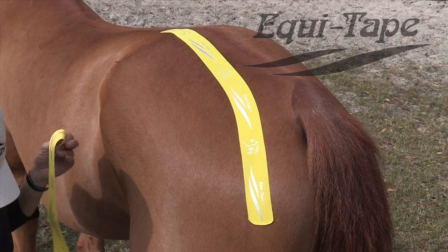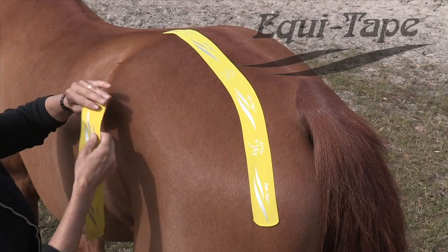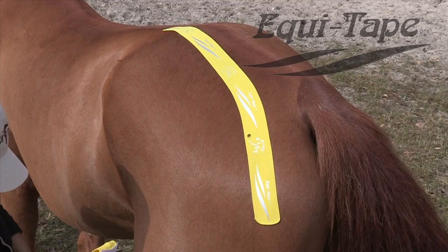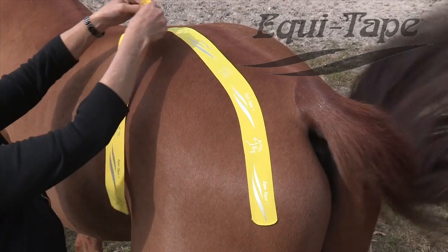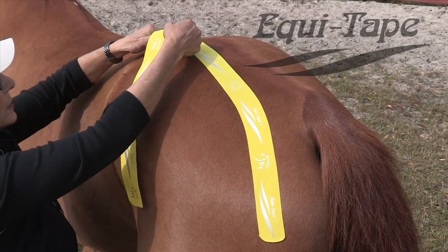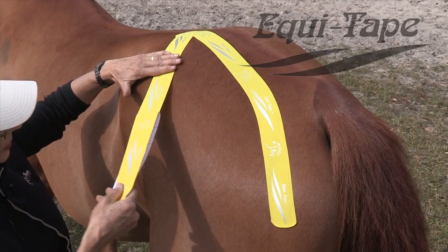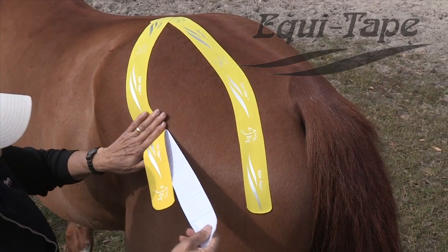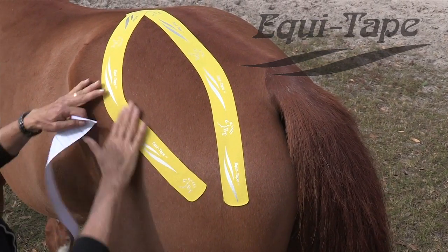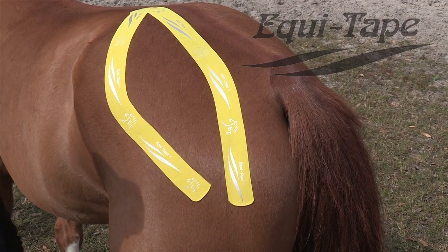That's the first piece of tape. For the second piece of tape, we're going to follow the gluteal medius muscle around on the other side. I'm going to tape again by tearing the tape, placing it with no tension halfway on top of the first piece, and I'm going to lay the tape down along the line of the outside of the gluteus medius muscle with very little stretch and no stretch at the end. Rub it to activate the adhesive and there you have it.